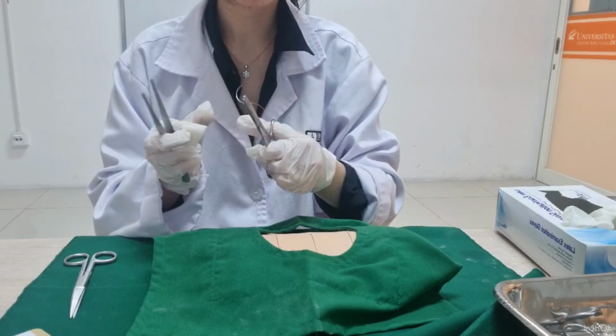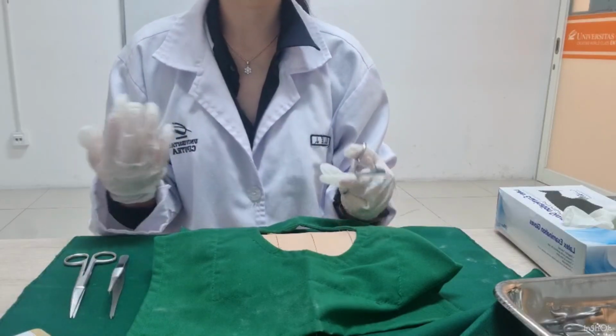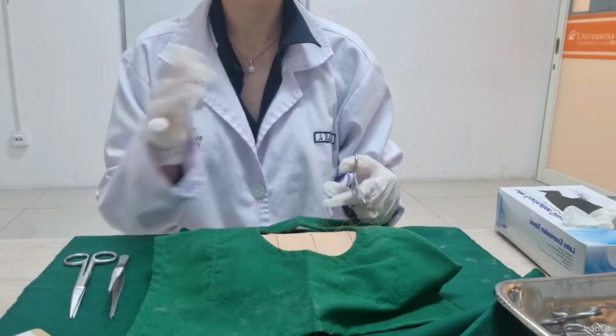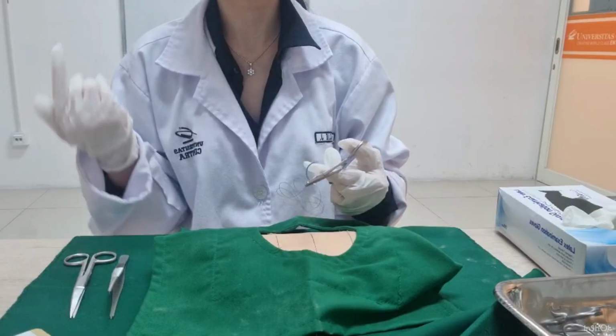And I will lock it now. Okay, so it has been locked. And I will insert the needle into the skin on the first side at an angle of approximately 90 degrees. It will enter the subcutaneous tissue and pass through the middle of the wound. And I will insert it further through the subcutaneous tissue so that it will penetrate the other side.